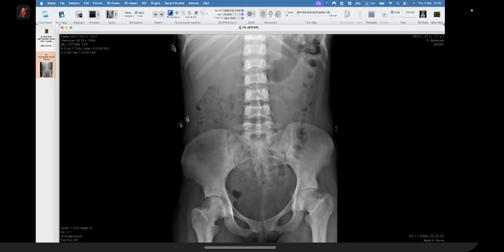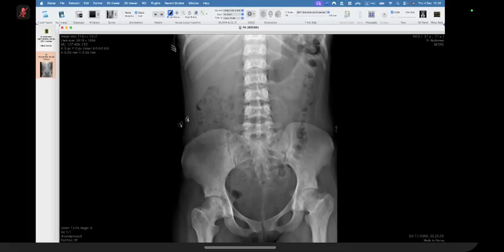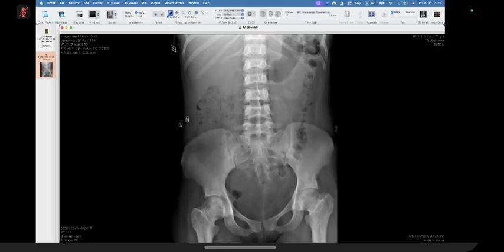You all must learn how to close the case. You guys are struggling, right? You don't know how to close the case. It's a trick that you have to learn. And not every case has to be given like I have to refer this and I'm going to refer that and I'm going to refer this. A lot of these patients, you can just say, I can't see any evidence of bowel obstruction. I don't see any gallstones. I don't see any autosplenectomy in terms of calcification of the spleen. I'll let the clinical team know.